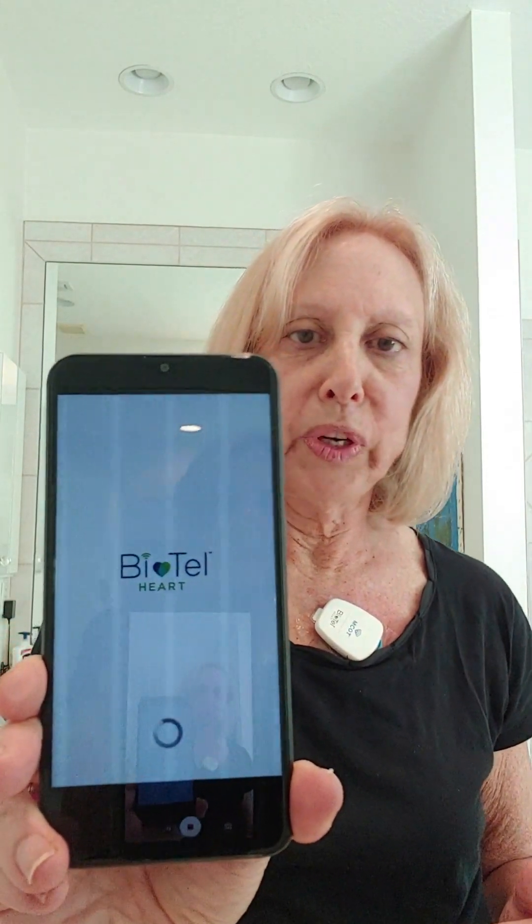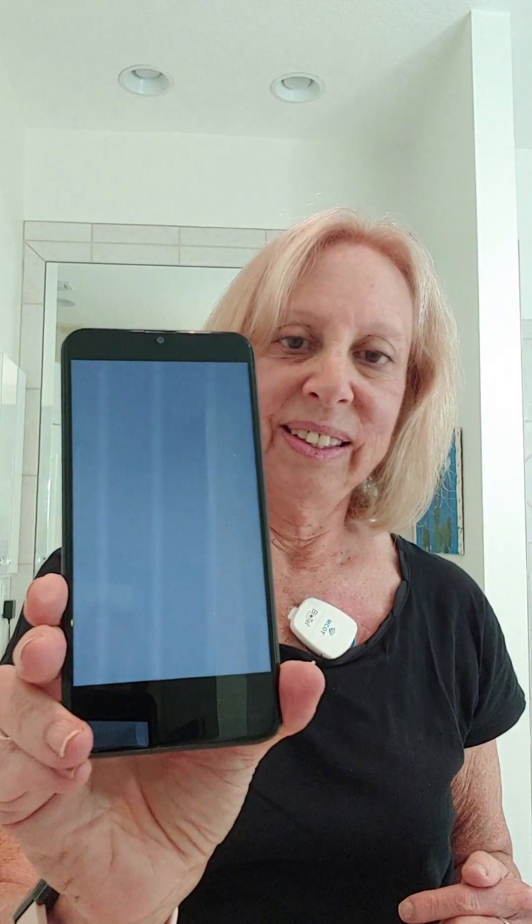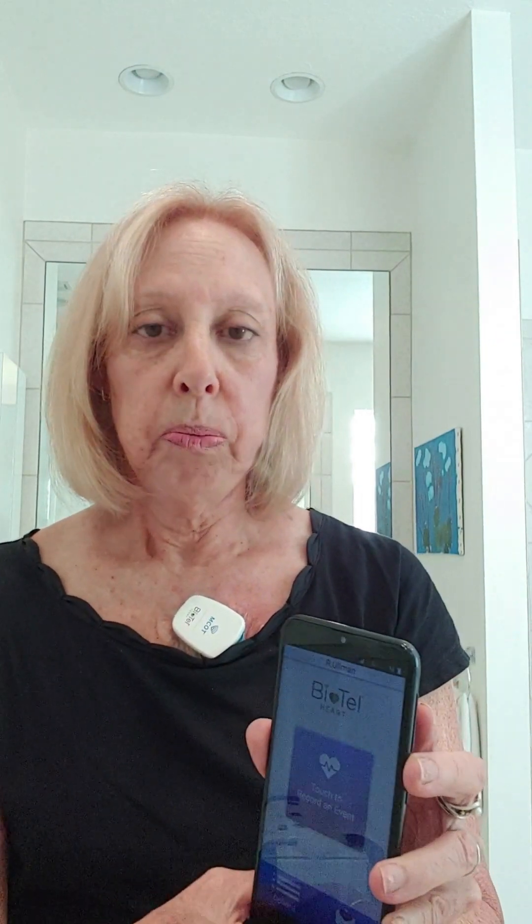The monitor makes a little startup sound and shows the main screen. You can push the button anytime to light it up — your messages and options are there. Under 'monitor options' you can adjust volume (currently on medium), change language, set it to vibrate, or enable airplane mode for travel. It automatically sends a baseline test, so you probably won't need to do that manually. No messages for me — good to go. Good luck with yours!